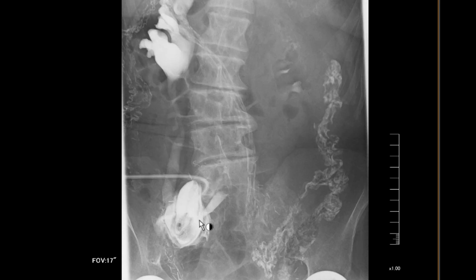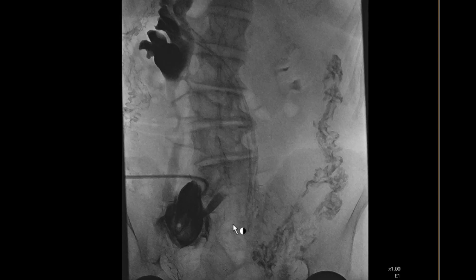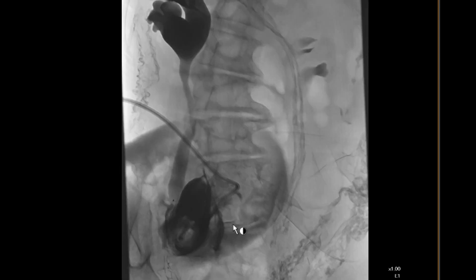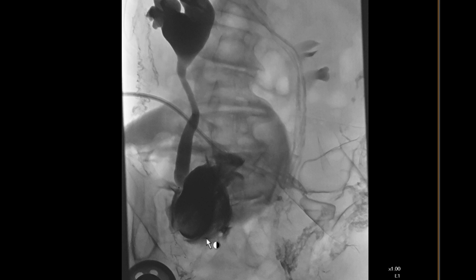What's interesting is we start to see contrast that is not confining to the borders of the conduit nor the ureter. It looks like it's leaking outwards, and you can see throughout the study that contrast is leaking outwards. This was highly suspicious for a leak involving that urinary conduit.